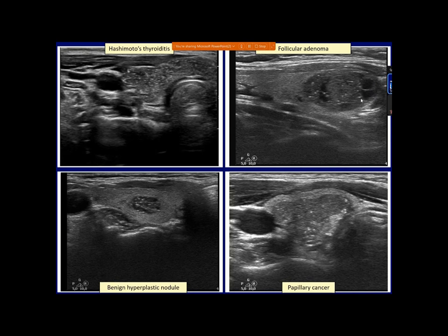In this case, echogenic granules prevail, but almost all of them are located dorsal to tiny cystic areas, so these should not be regarded as clear forms of microcalcifications. These are very likely back wall figures. This lesion, which proved to be papillary cancer, has microcalcifications. So this irregular, not this regular shape of the nodule is a very important argument in decision, and these irregular lobulated margins in that nodule have influence on our judgment on the echogenic figures.